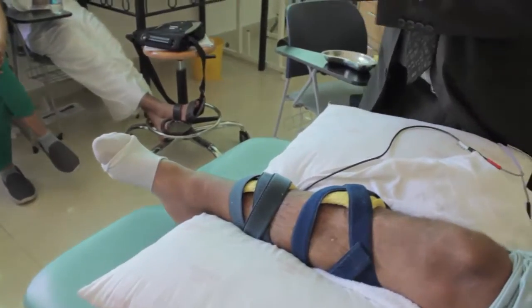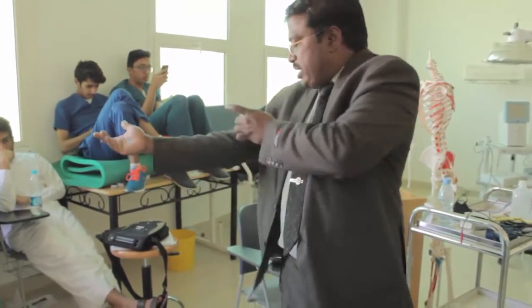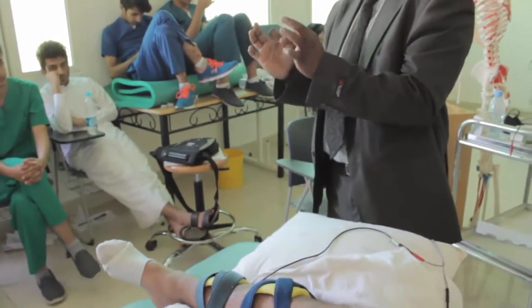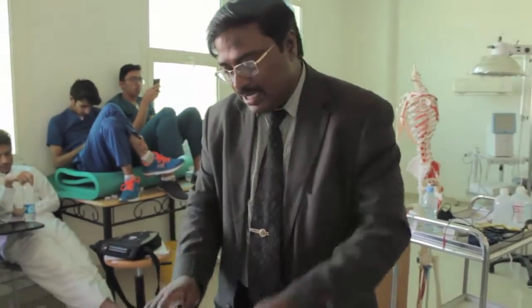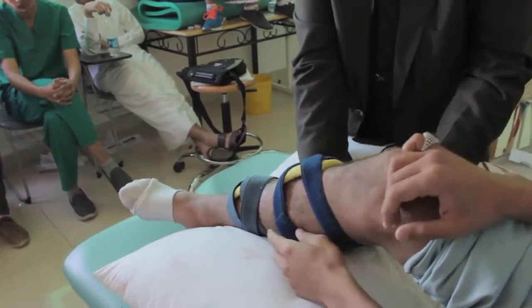But if it is a small muscle like biceps, then the size of the electrode should be small. It cannot be big, the electrode should be a smaller one. There are different kinds of placements. This is for dorsiflexors. I will show you placements with the electrodes.